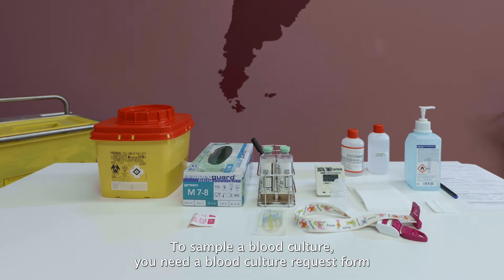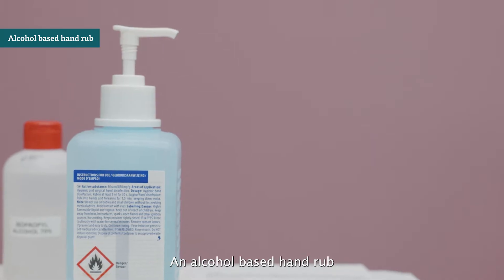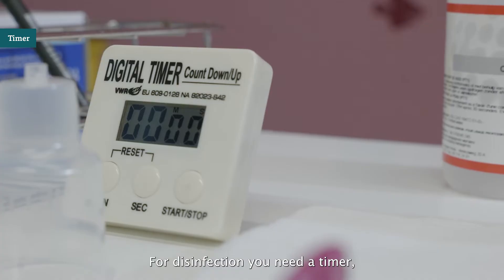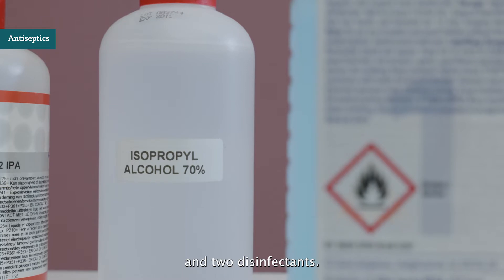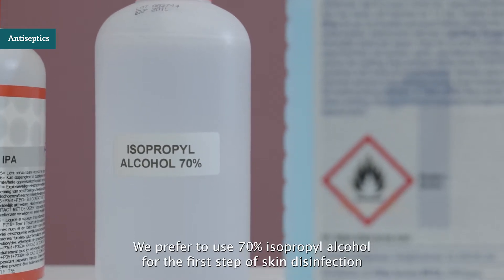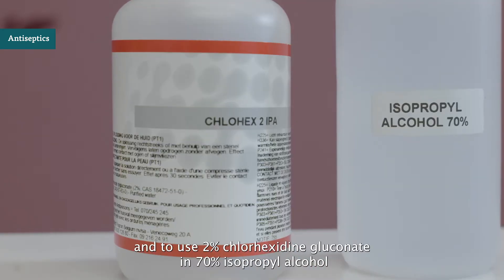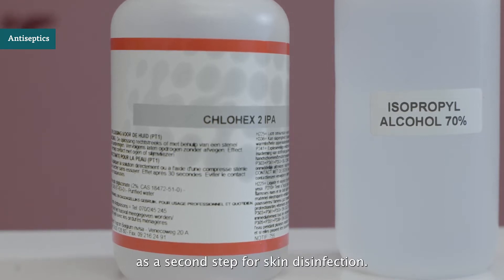To sample a blood culture, you need a blood culture request form, a permanent marker and a pen, an alcohol-based hand rub, and a minimum of one pair of non-sterile gloves. For disinfection, you need a timer, 5 dry compresses per blood culture set, and 2 disinfectants. We prefer to use 70% isopropyl alcohol for the first step of skin disinfection and disinfection of the blood culture bottle and holder, and 2% chlorhexidine gluconate in 70% isopropyl alcohol as a second step for skin disinfection.